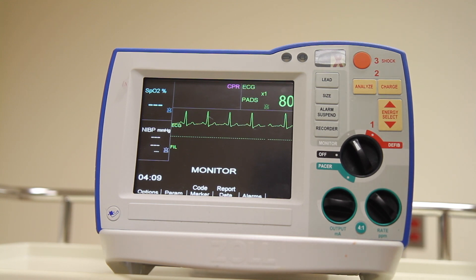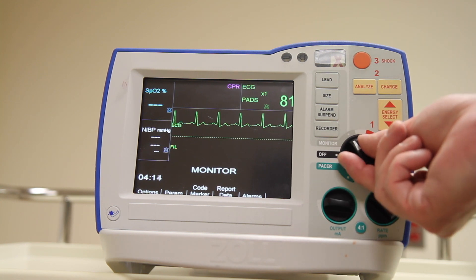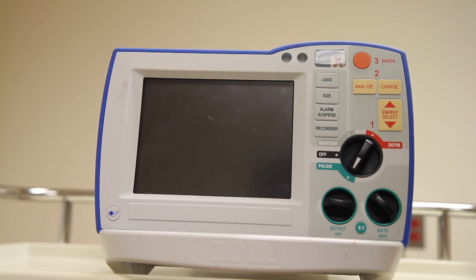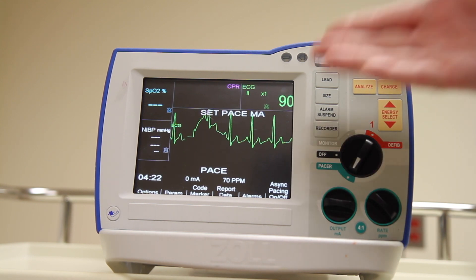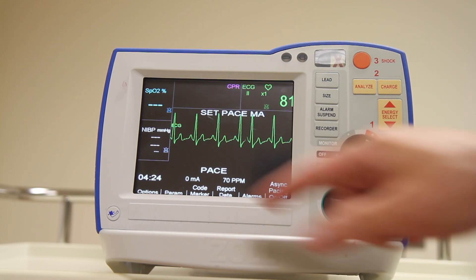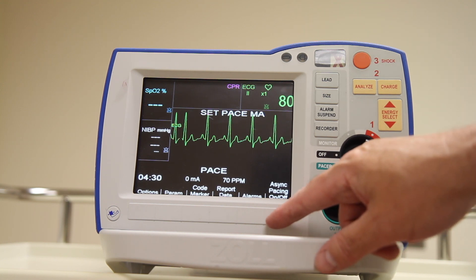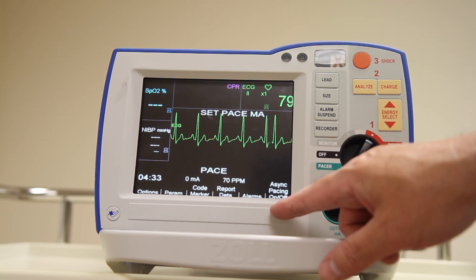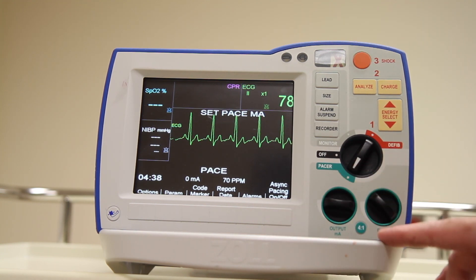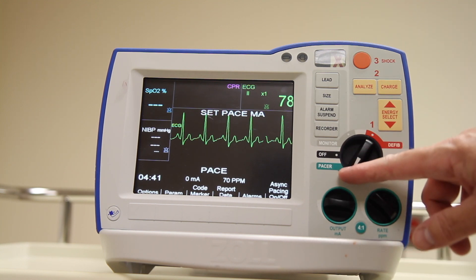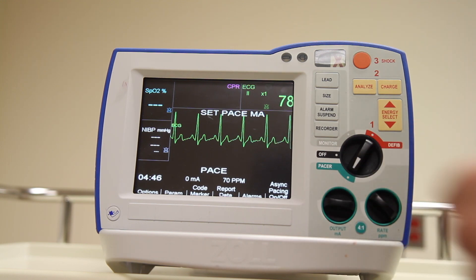The last control we have to concern ourselves with is the pacemaker controls. By switching the dial down to pacemaker, we will see the patient's rhythm. Down along the bottom we have different functions associated with the soft buttons — one of them is to turn on or off asynchronous pacing.